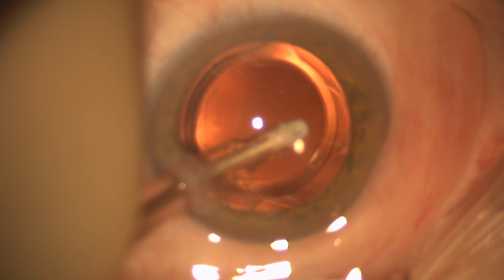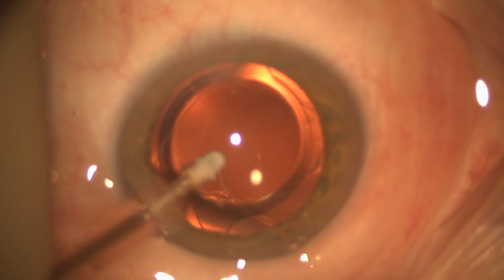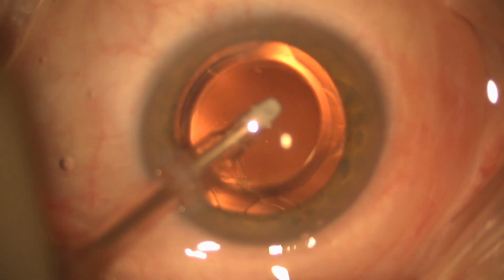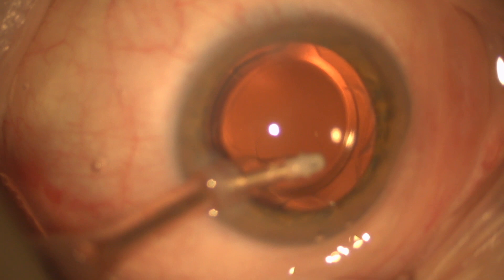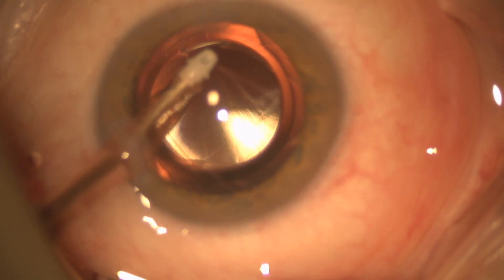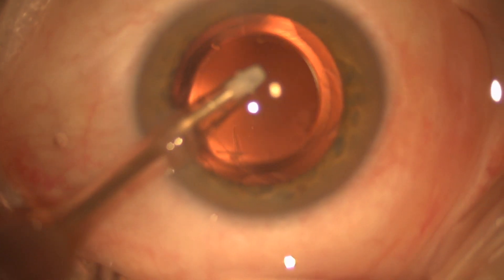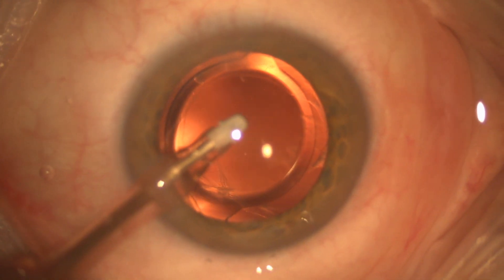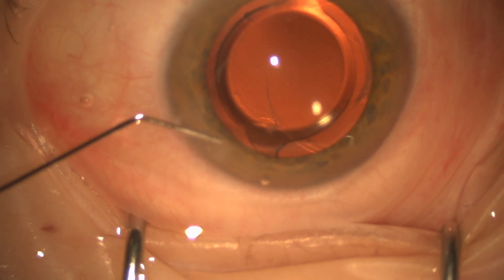I apologize the view is a little bit blurry on this section, but right there you can see that there's some vitreous that comes into the I/A tip, so we stop vacuuming. We try to get the vitreous out of the I/A tip — you don't want to pull on the vitreous there, as you may cause some retinal traction. I'm still trying to remove the viscoelastic and there's the vitreous again. I'm actually just trying to get my I/A tip back; I was not vacuuming at that point. This is going to be a persistent problem of pulling on the vitreous if I continue to try to remove every bit of viscoelastic.